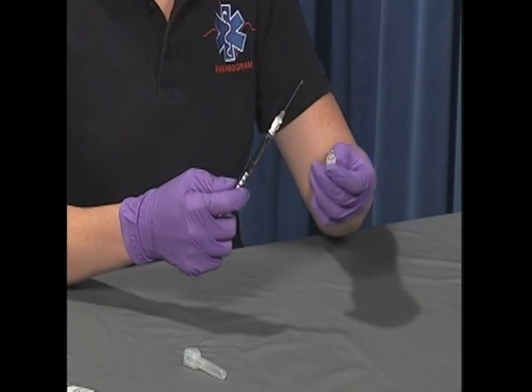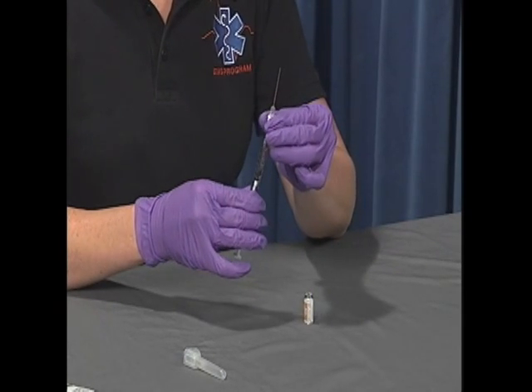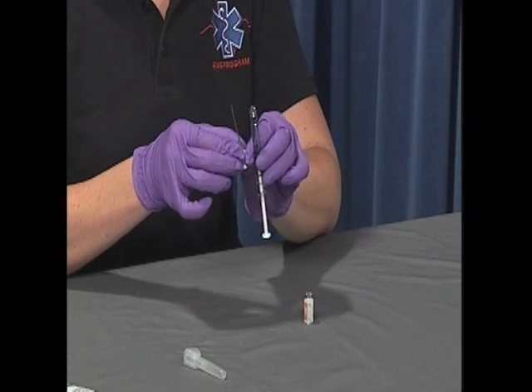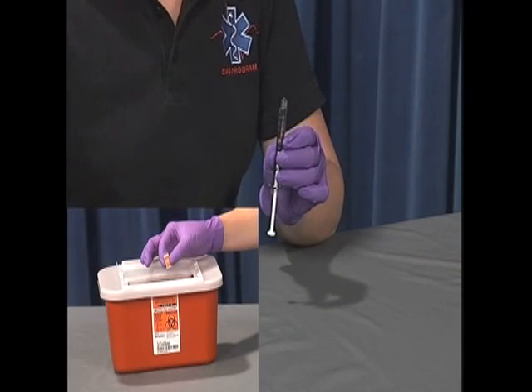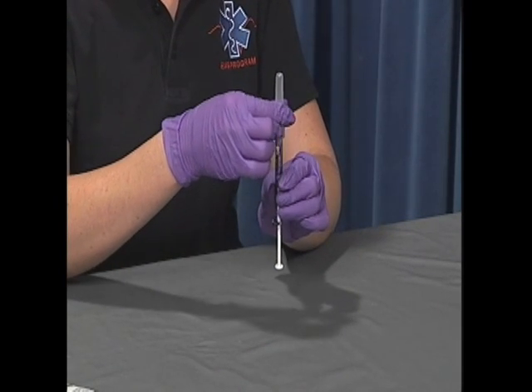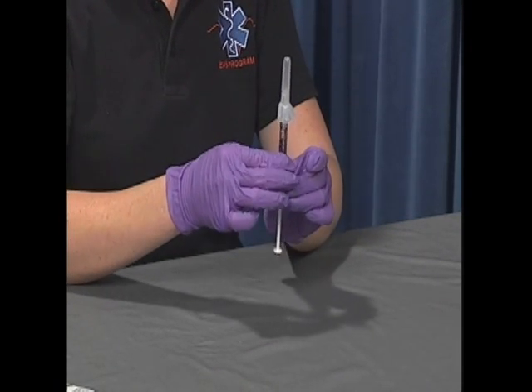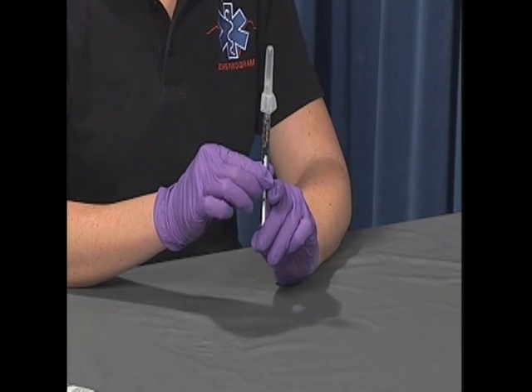After removing the medication, discard any remaining medication and properly dispose of both portions of the ampule in the sharps container. Remove the filter needle and properly dispose of in a sharps container. Replace the filter needle with an appropriate size, safety engineered needle for a subcutaneous or intramuscular injection.